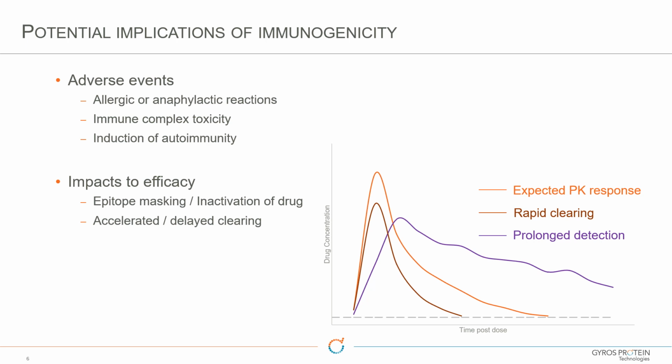Yeah, and certainly the clinical endpoint as well, right? Even if the drug is held in circulation longer, it may be blocked in such a way as to no longer have its effect, even though it's hanging around in the body a little longer. Yeah, just because you have an immune response doesn't mean that's going to have a clinical impact. So it's important as part of drug development to correlate the formation of antibodies against clinical events and reduction of efficacy. So it's important to monitor it.